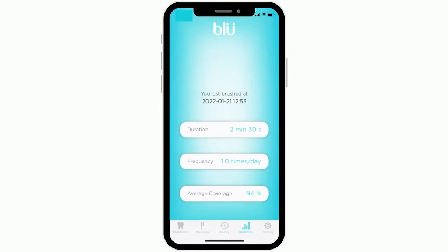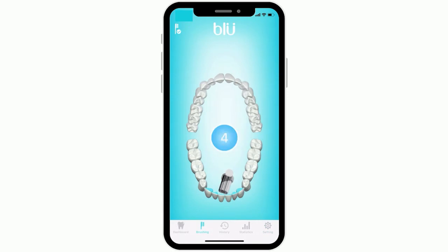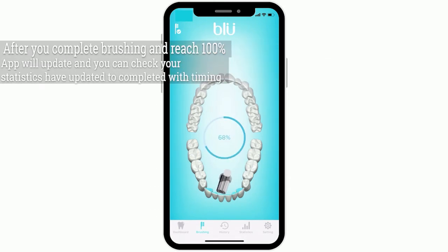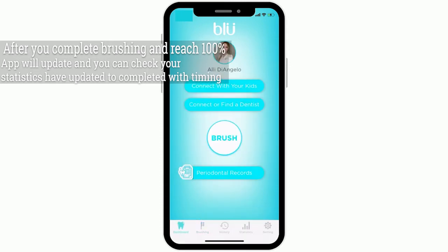After brushing, you'll get your statistics on your app, and that will show you the duration, frequency, and the average amount covered. When you want to go back to brushing, just hit the brushing on the dashboard and hit brush. You will now go back to that quadrant that you missed and complete your brushing process to get 100%. Once you finish brushing, you'll confirm that you flossed before brushing or that you are now going to floss your teeth, and then you have completed your brushing.